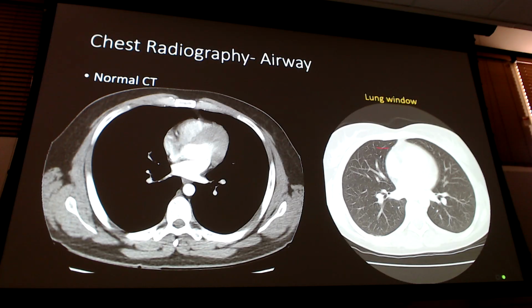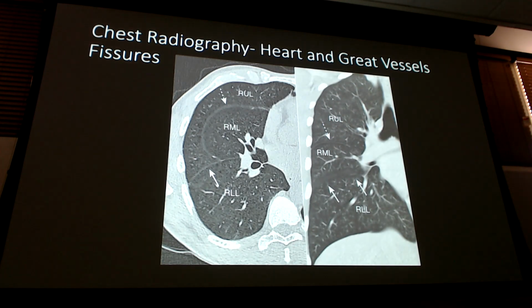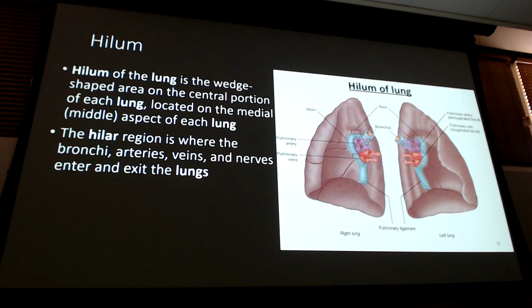Same CT, where we talk about the lung window versus the non-lung window, the soft tissue window. Look at how beautiful those lungs are on that lung window when I want to look at lung tissue. Not going to make you pull out fissures, but here they are. I might on the CT scavenger hunt at the end of the class just for funsies. But I won't make you pull it out on the test.